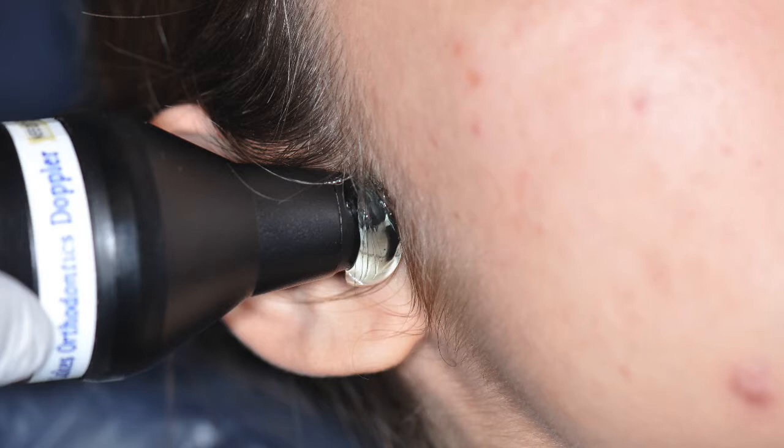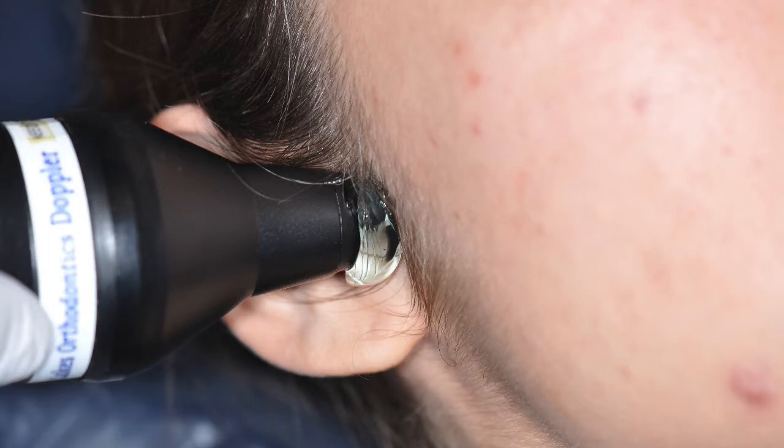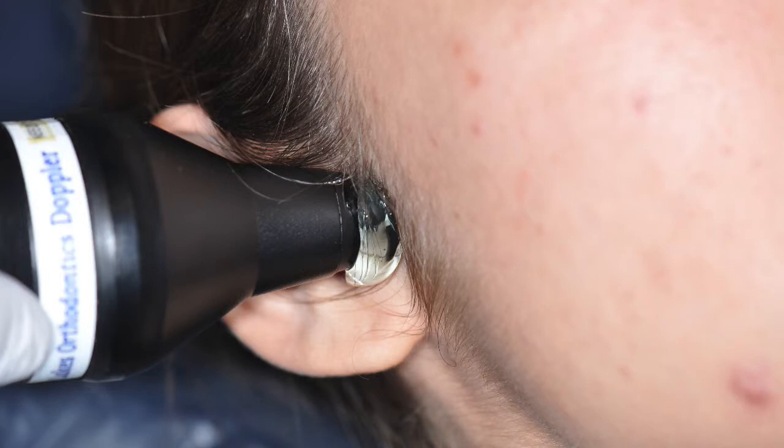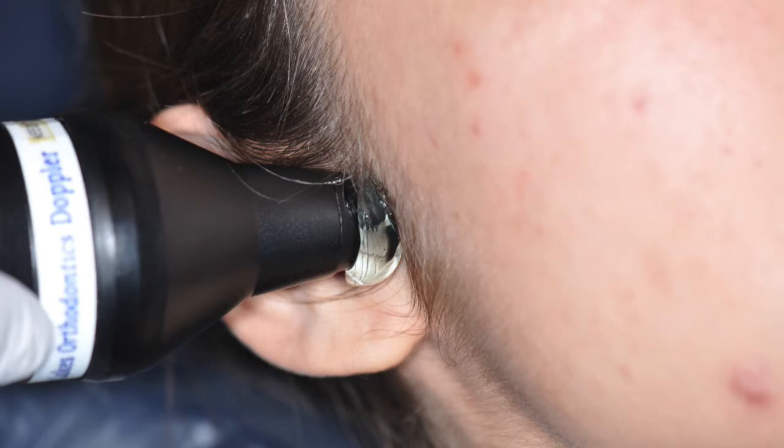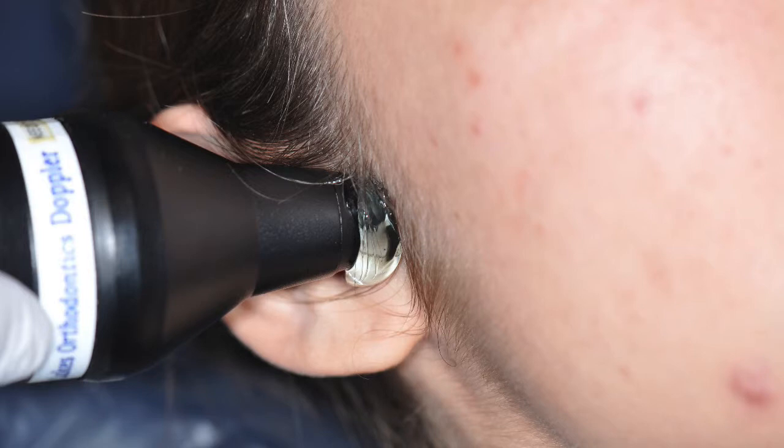One of the reasons we are so curious about joint sounds is it helps us answer the question: where is the disc? The only definitive way to answer that question is with MRI imaging. But listening to the joint, figuring out palpable joint sounds, pops and clicks, and more importantly the only kind of joint sounds we can auscultate — which are crepitus — is a very important piece of answering that question.